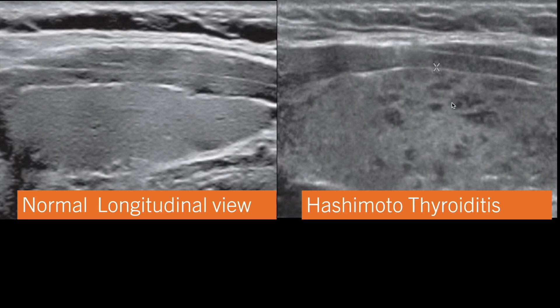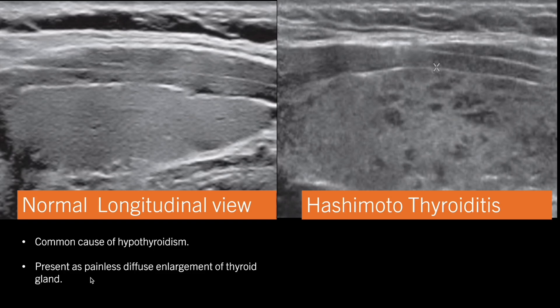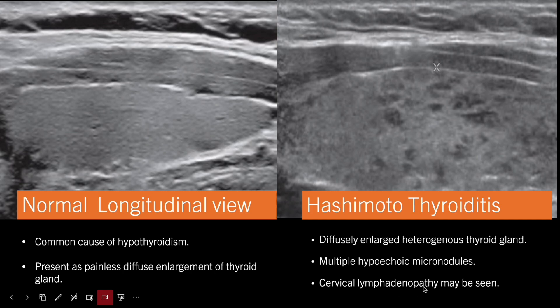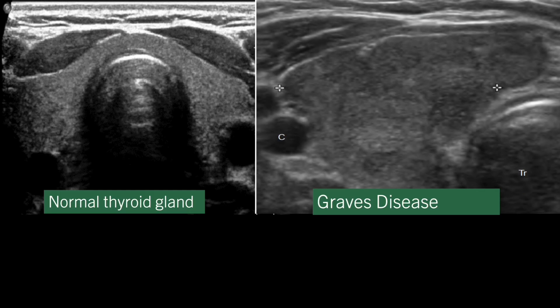Here we can see a normal thyroid lobe compared to a thyroid lobe in Hashimoto thyroiditis. Hashimoto thyroiditis is the common cause of hypothyroidism and usually presents as painless diffuse enlargement of the thyroid gland. On ultrasonography, the thyroid is diffusely enlarged and the thyroid parenchyma is heterogeneous. Another important finding is multiple hypoechoic micronodules. Sometimes cervical lymphadenopathy may be seen, but it is generally more associated with thyroid malignancy.